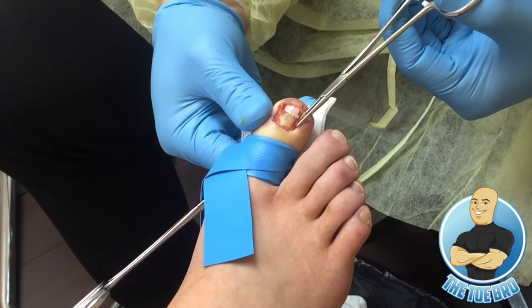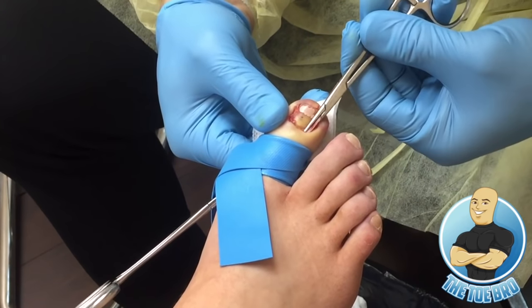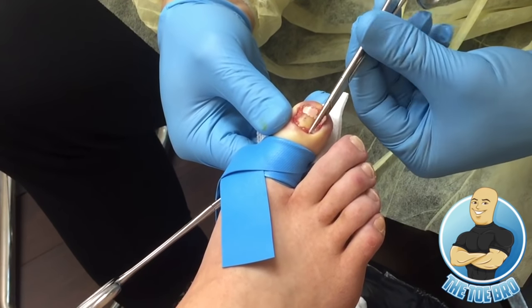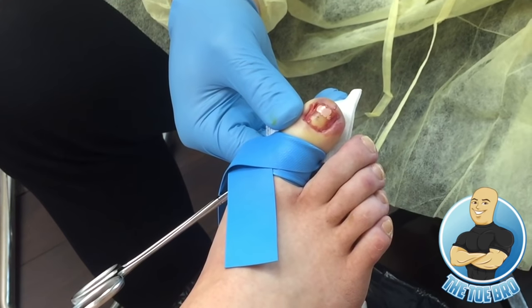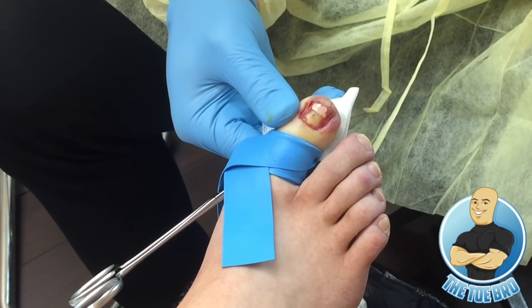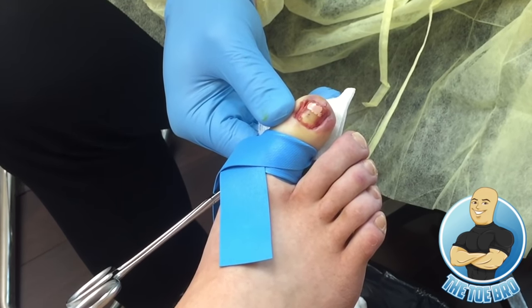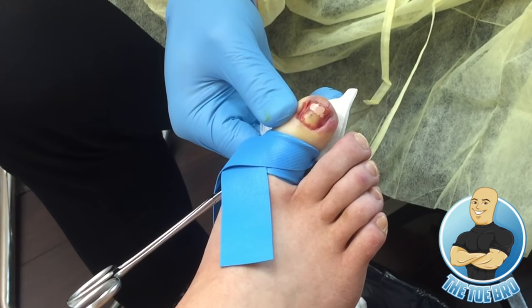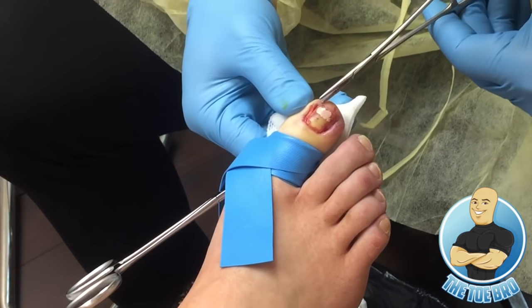Now we will be using a hemostat to clamp onto the ingrown portion, and once it's clamped onto the ingrown portion, we turn it towards the midline of the nail. This is to properly remove the ingrown, to minimize the amount of damage to the remaining nail. This is always the fun part, because after turning that hemostat toward the midline of the nail, we could see how much of that ingrown nail was actually stuck in the skin and how much comes out.